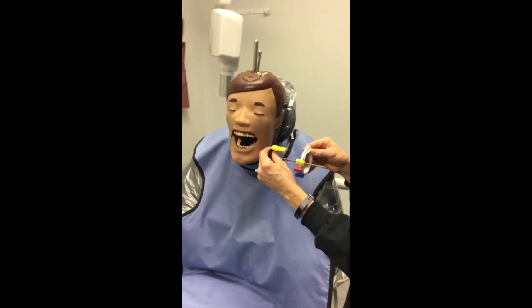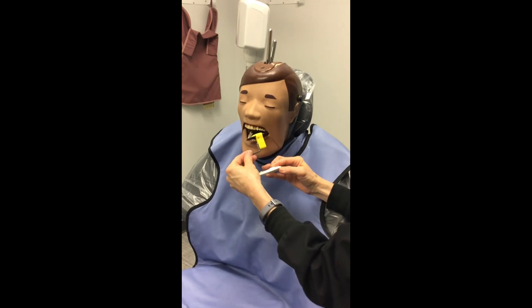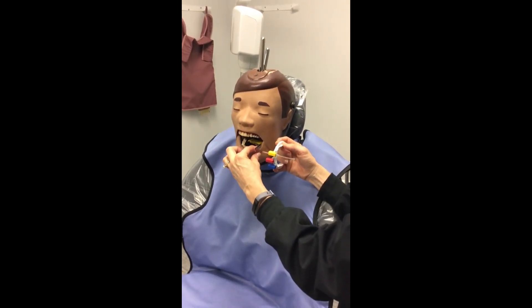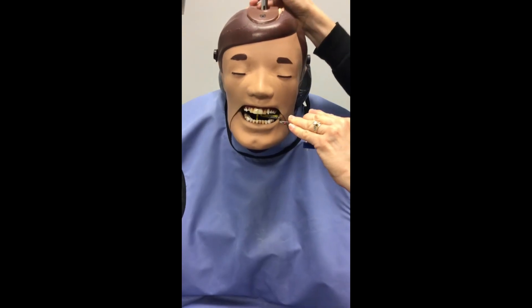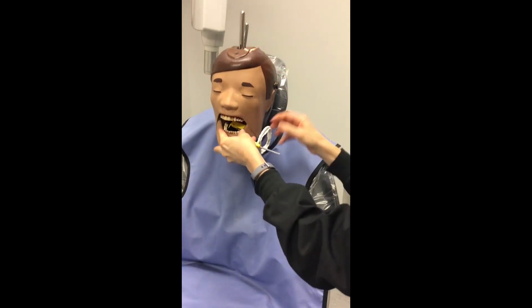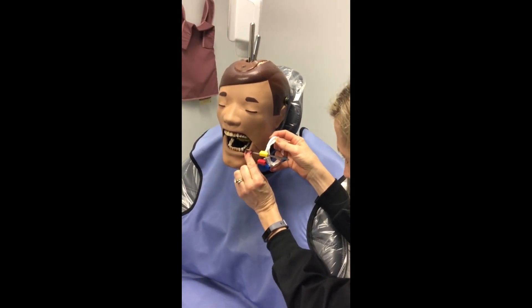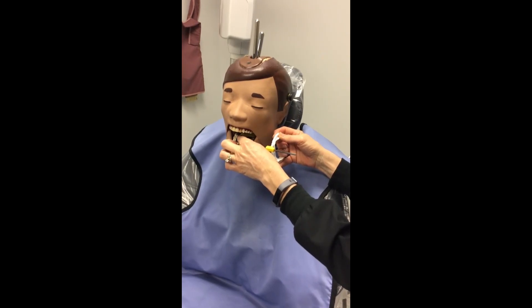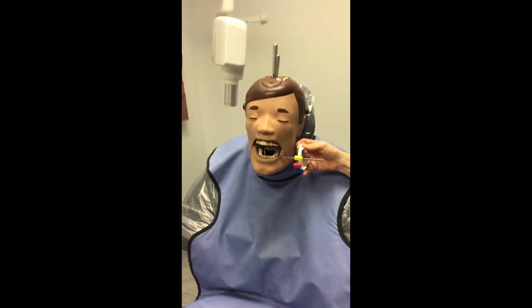Come to the other side — the same principles as your bite wings apply. The front will come between your mandibular incisors. Take it in, get it inside the patient's cheek, place it on the lower teeth, and angle it so the front of your PSP plate is between your central incisors, then have your patient bite down. Line up your tube head like we've discussed. Get your next PSP plate and do your molar projection — identify where your second premolar is, take the front of that packet to halfway at the second premolar, have your bite block sitting on the lower teeth, make sure your PSP plate is angled toward the central incisors, and have your patient bite down before lining up your tube head.